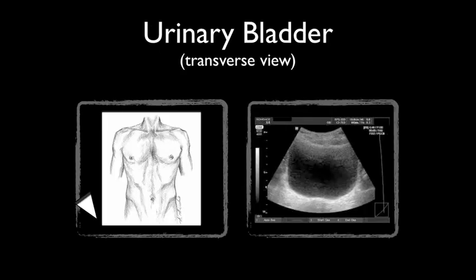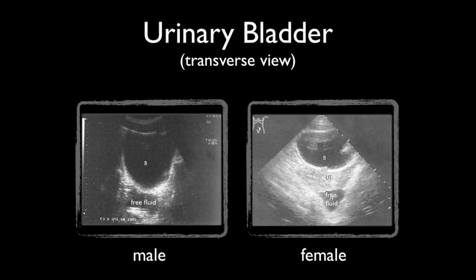To visualize the urinary bladder in the transverse plane, place the ultrasound probe approximately 2 centimeters superior to the pubic symphysis. Here's an example of a full urinary bladder. In these two examples, free fluid can be seen posterior to the bladder. In the female scan, note the position of the uterus between the bladder and the free fluid. This is the pelvic cul-de-sac, or the pouch of Douglas, which is another potential space between the uterus and the rectum. Best images are obtained when the bladder is full.